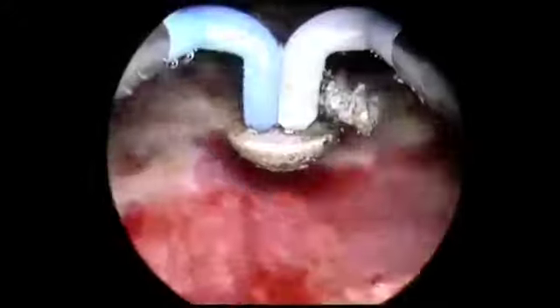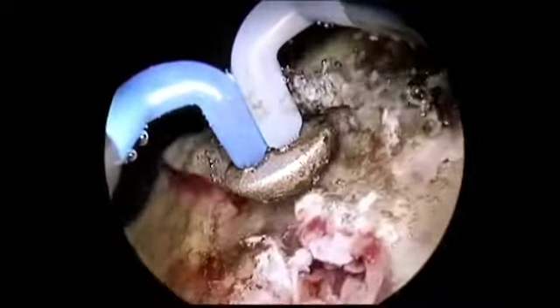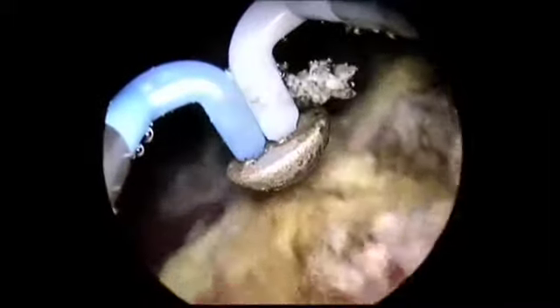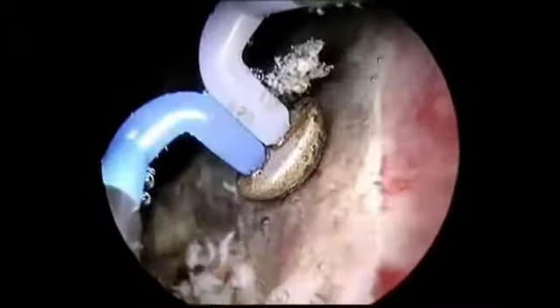Deep biopsies of the tumor base are then taken. This will help to ensure that accurate staging information is provided to the pathologist. Although in contrast to a traditional TURBT, we do not provide as much tissue to the pathologist for pathologic review, we have not had any difficulty obtaining accurate stage information in order to appropriately treat these patients.